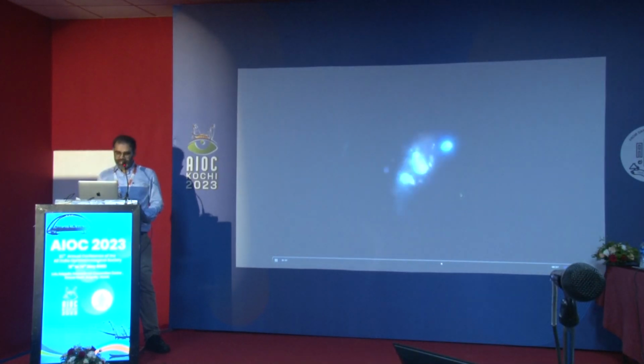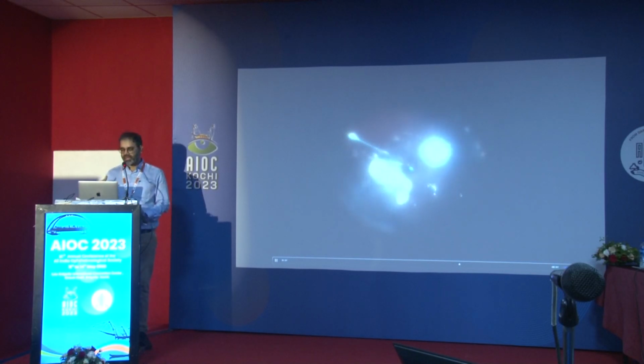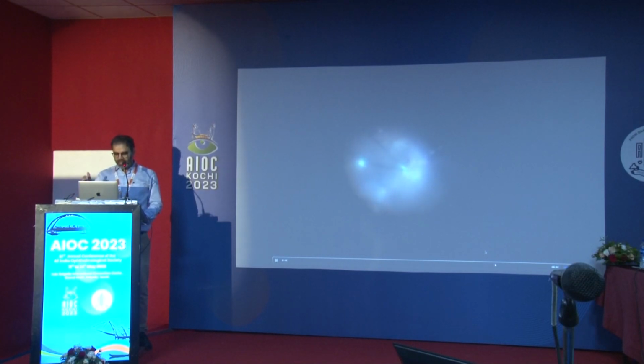Here they say that the corneal epithelium can cause hyperplasia, but in our case we didn't have any hyperplasia or inflammation post-op. Secondly, the corneal epithelium got amalgamated within the hole, and it shrunk. I have been following this patient for more than a year now, and you can see that after putting the oil, the graft which we had put moved away, but again we maneuvered it over the hole.